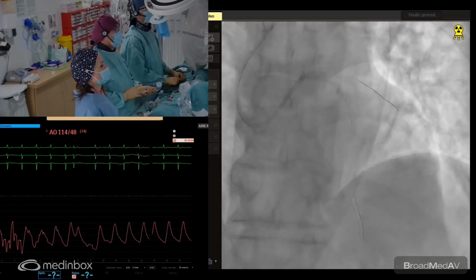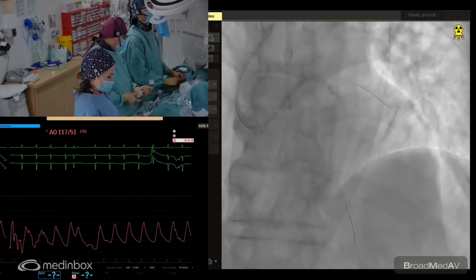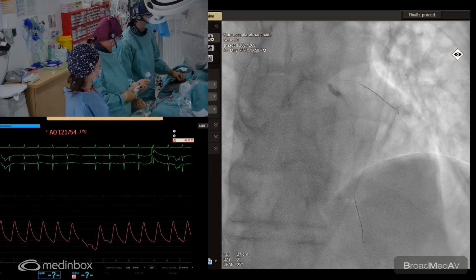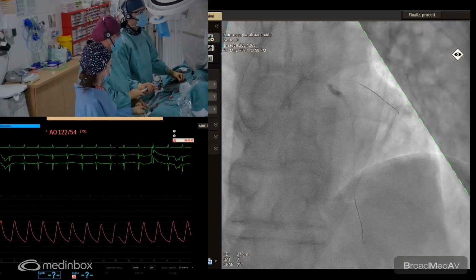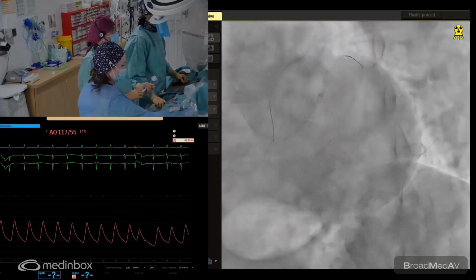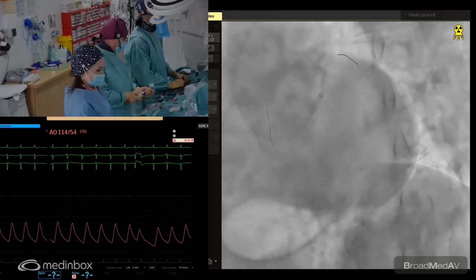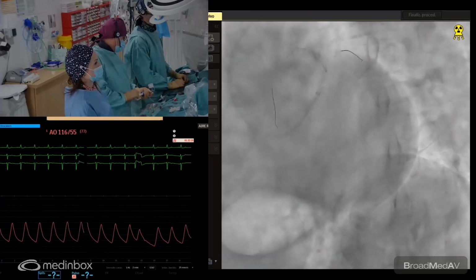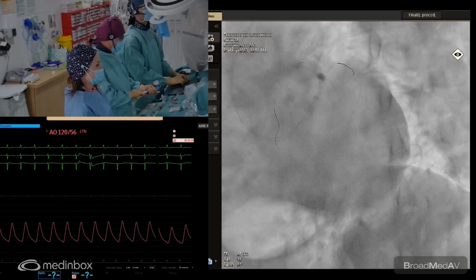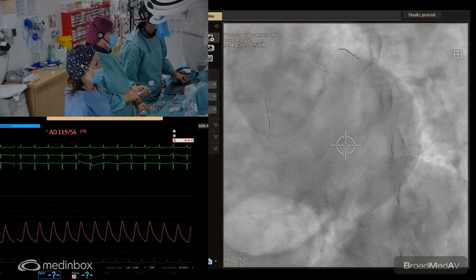Probably from here is the proximal. Okay, let's go. 12. Perfect. Down. I'm going to use the spider view for the proximal part. Okay, down. And then just the proximal part of the stent. Probably more caudal is better.